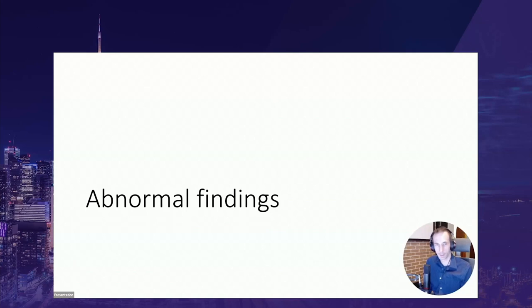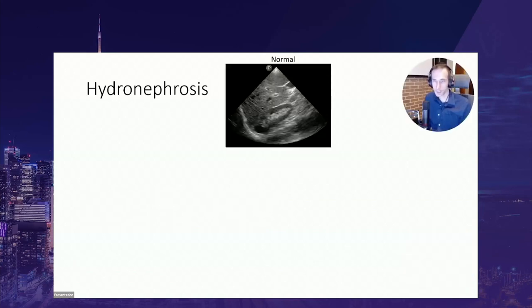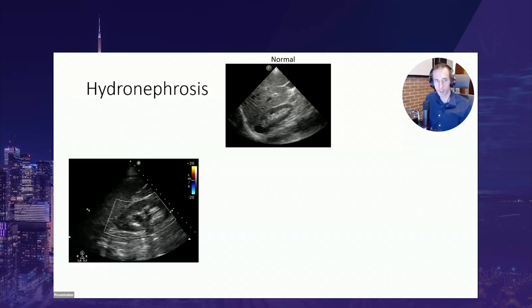Moving on to abnormal findings: the first thing to rule out in a patient with anuria, reduced urinary output, or kidney failure of unknown cause is urinary obstruction. Even if a Foley catheter is inserted, obstruction may be on the upper part of the urinary system. On screen you can see a normal kidney with a bright, ecogenic renal sinus and no collecting structures visible. As hydronephrosis develops, the collecting structures become dilated — this shows mild hydronephrosis and then moderate hydronephrosis with major calyces dilated.